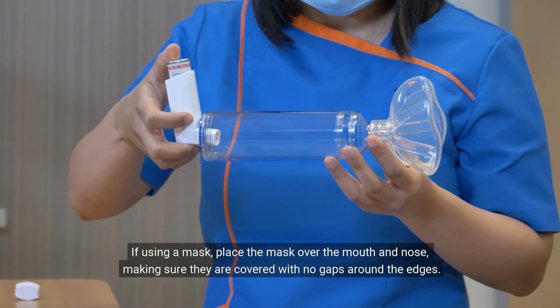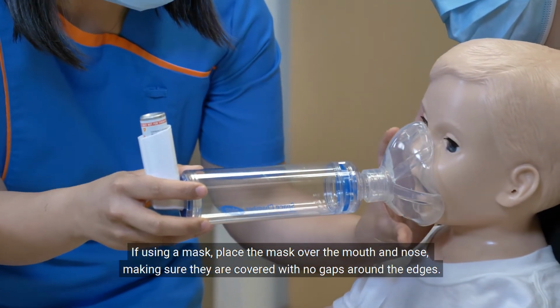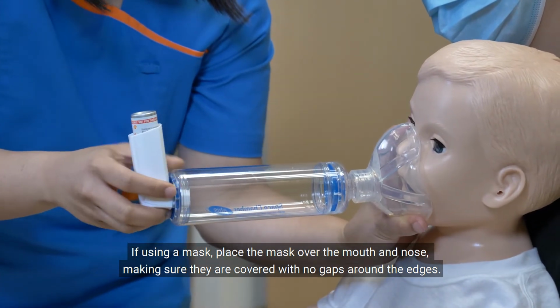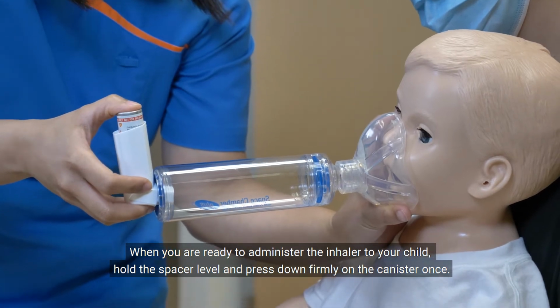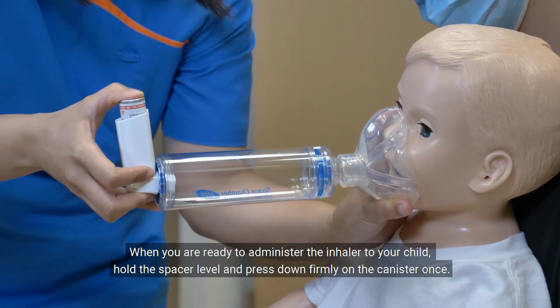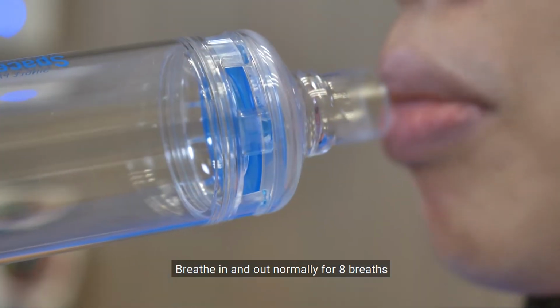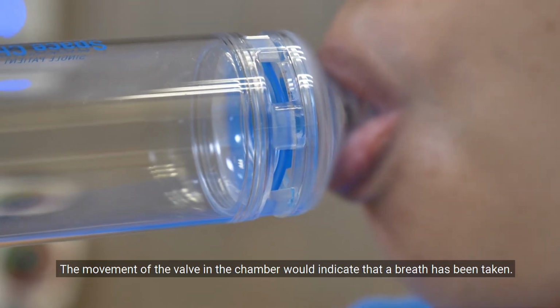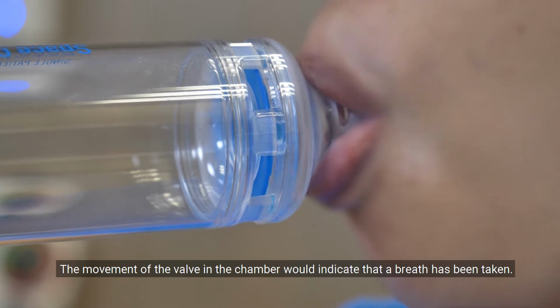If using a mask, place the mask over the mouth and nose, making sure they are covered with no gaps around the edges. When you are ready to administer the inhaler to your child, hold the spacer level and press down firmly on the canister once. Have your child breathe in and out normally for 8 breaths. The movement of the valve in the chamber would indicate that a breath has been taken.